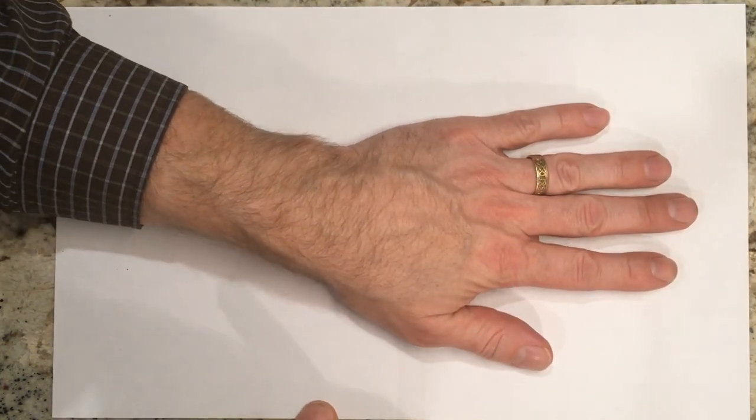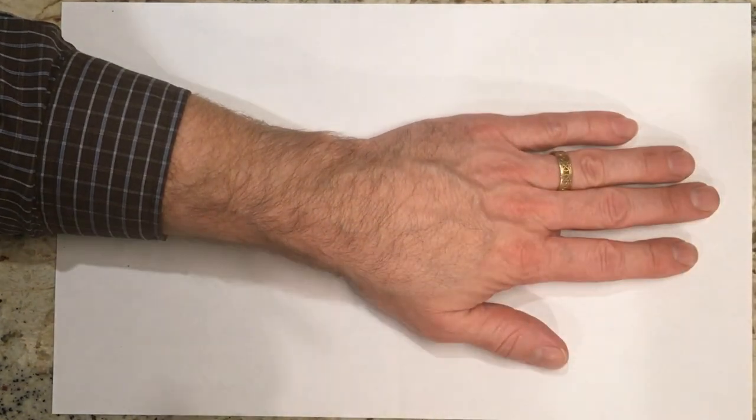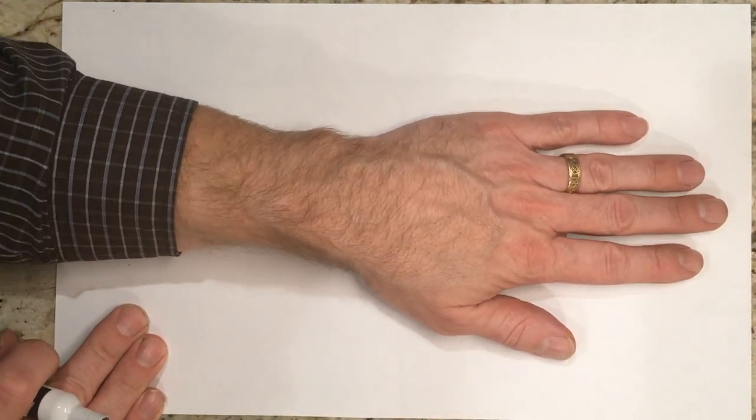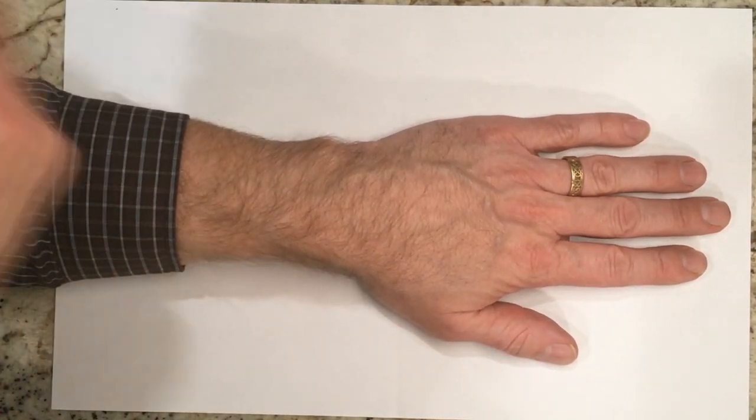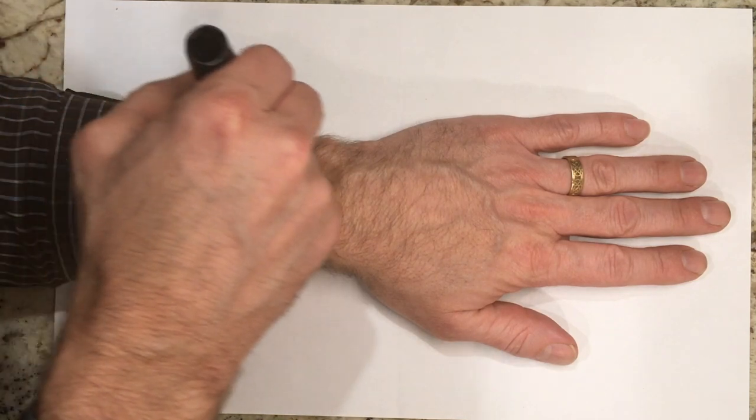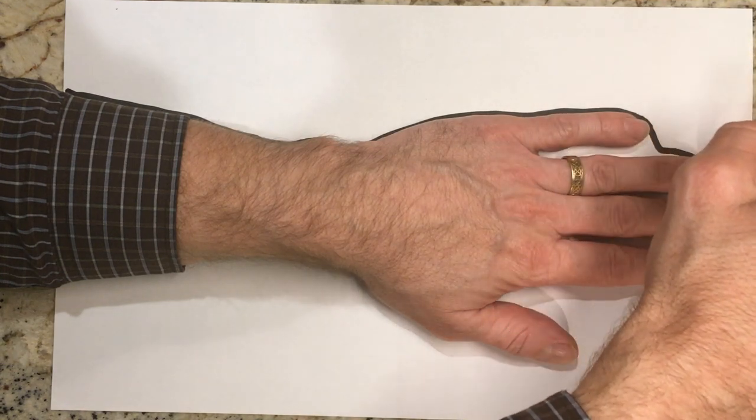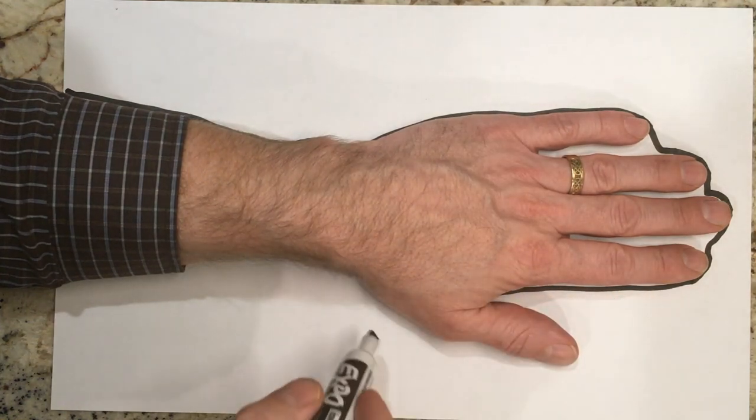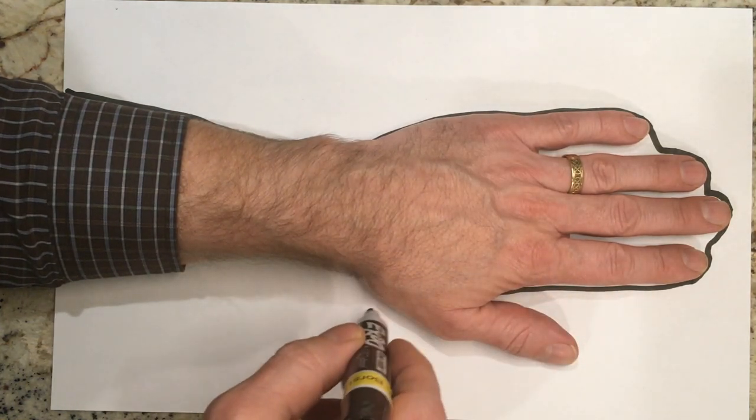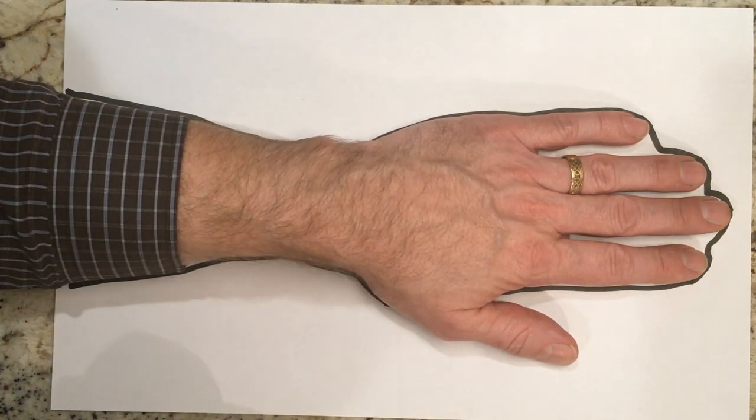The first thing you're going to do is have your client place their hand on a piece of paper or paper toweling so you can trace the shape of their hand and some landmarks. Just trace right along the outside of their hand, skip going around the thumb because we're going to do that separately, and then come up the arm about up to the thumb.